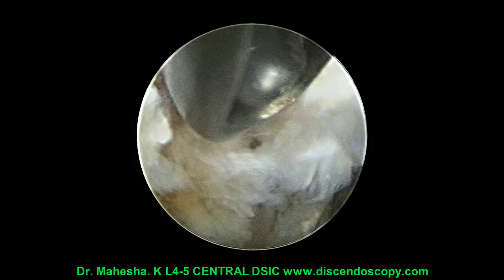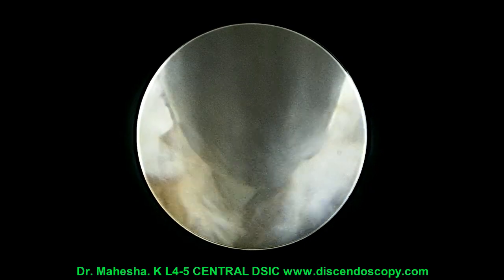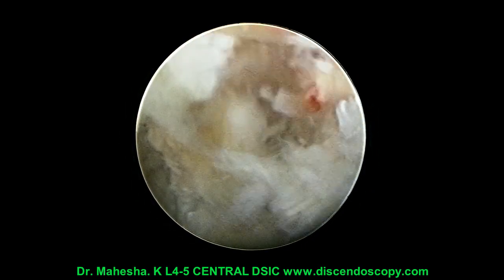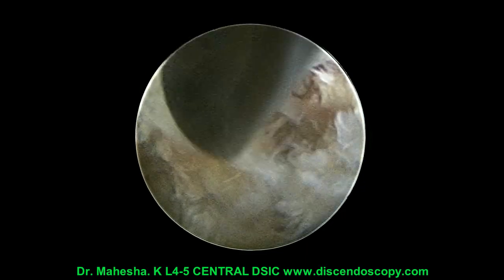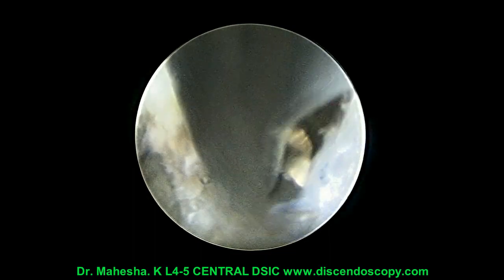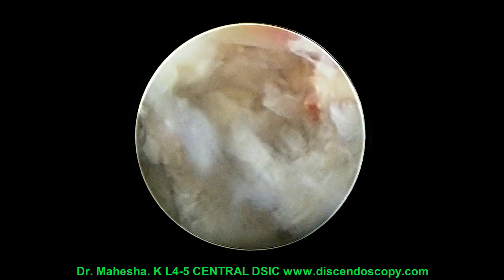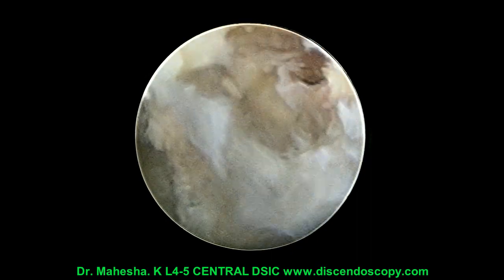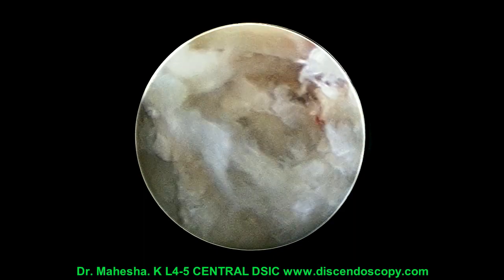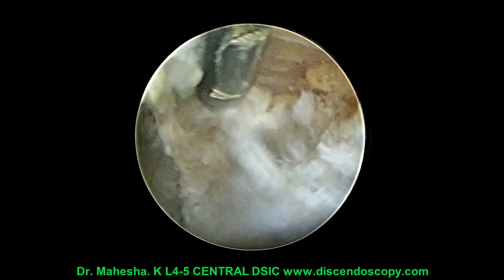With 3-4 bites of the annular cutter, you can clear this redundant annulus. Once we are done with annulotomy, RF is used to clear the redundant tissues.